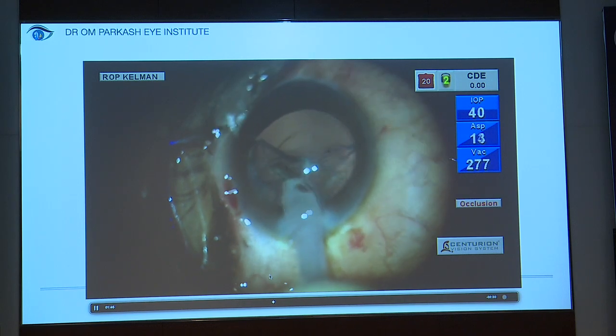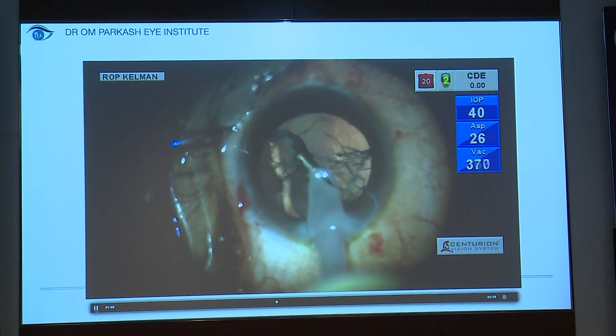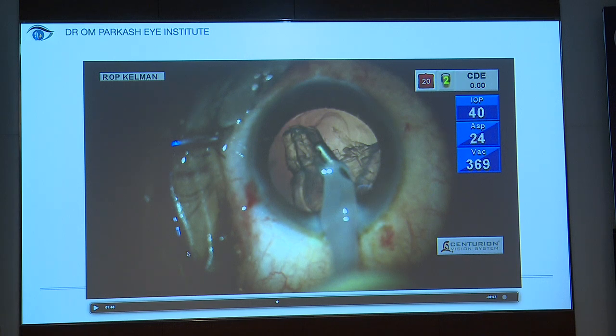What I'm doing now is, the ideal situation when you have an open posterior capsule is that you should do a bimanual one. Why is a bimanual one done? Because we want a different plane of irrigation and a different plane of aspiration. Here the trick which I have done is, I have retracted the sleeve. This retraction of sleeve is a compromise, no doubt. Having a bimanual is a much better one. But this is a way how we can have a biplanar with a coaxial one. So what I have done is I have retracted the sleeve.